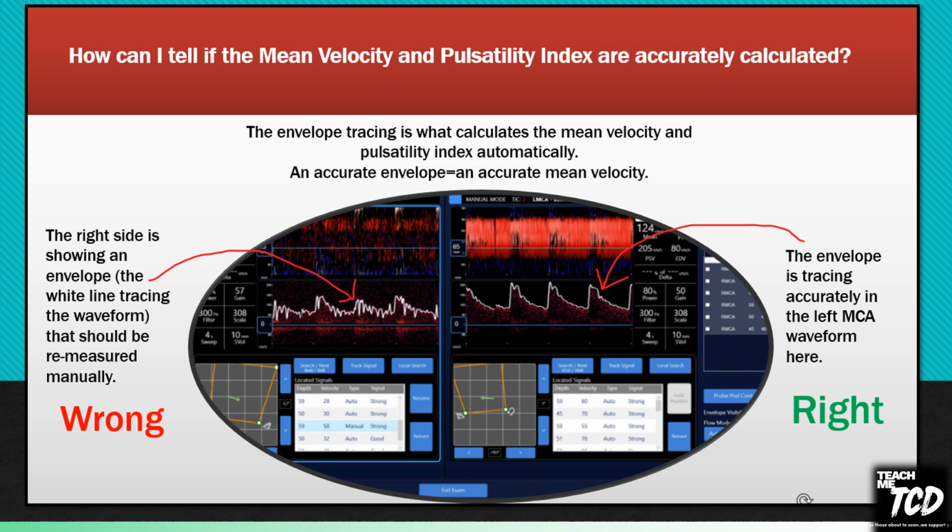accurate. If you look on this image on the left, you can see the white line over the waveform. That is the envelope. We need to ensure this looks like the right side where it is tracing that waveform accurately. The one on the left needs to be remeasured manually to create an ideal or accurate mean velocity.